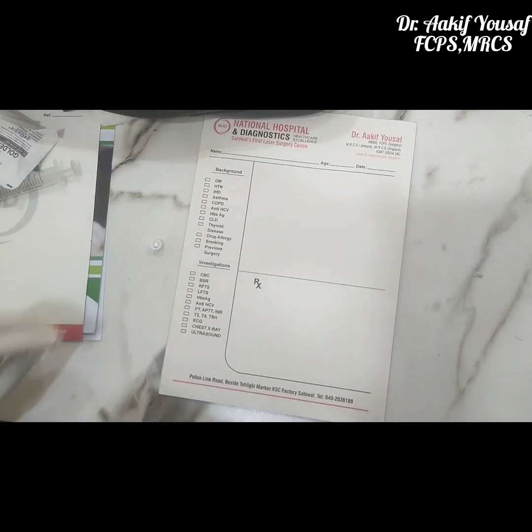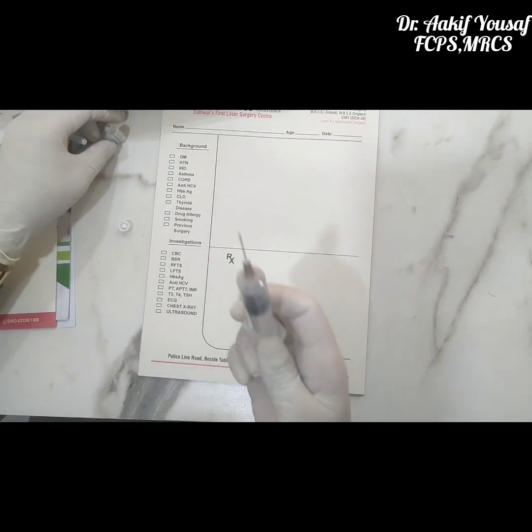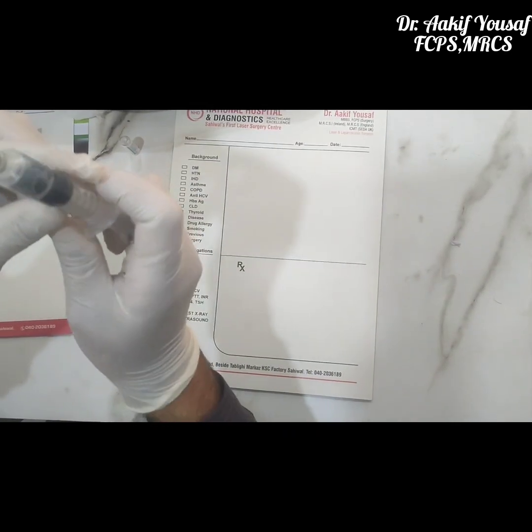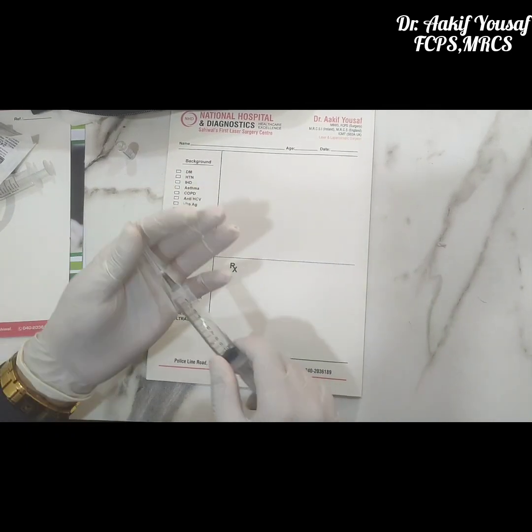So we will take one ml of the STD injection in a syringe. We will then fill up 9ml of air into the syringe to make it a total of 10ml.